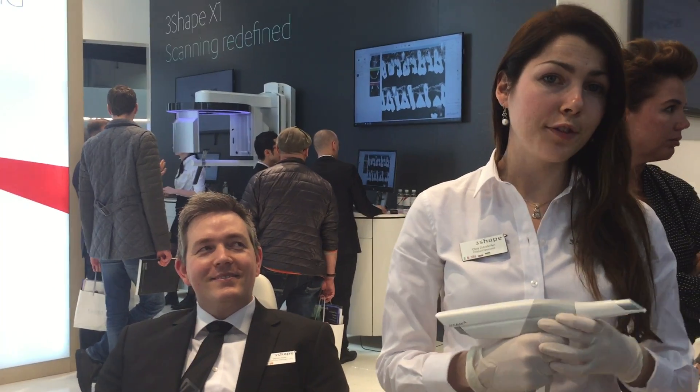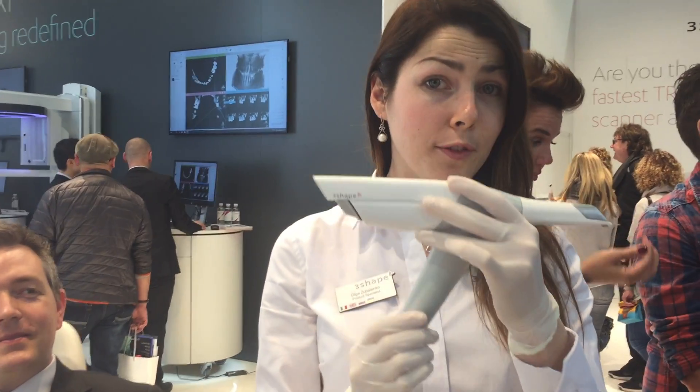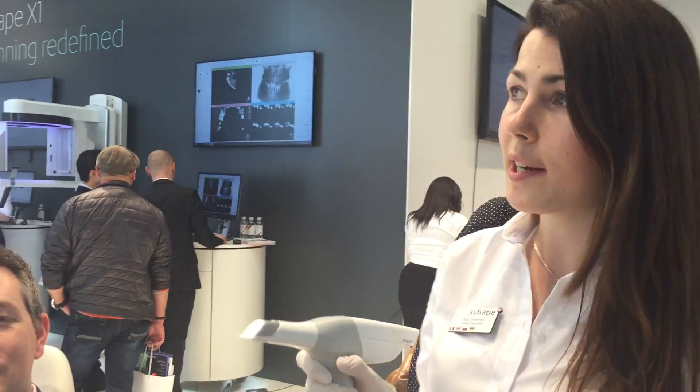Hello, my name is Olga, I work for 3Shape, and today I'm proud to introduce to you the world's first intraoral scanner wireless, which is the 3Shape solution. I will show you right now how it actually works.